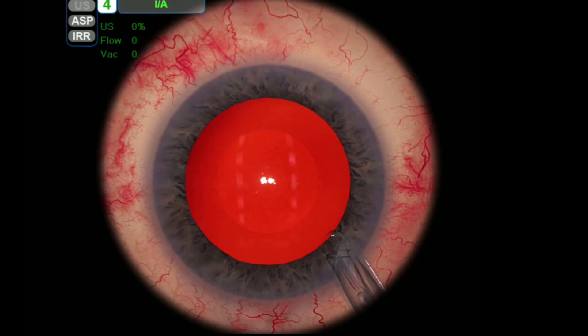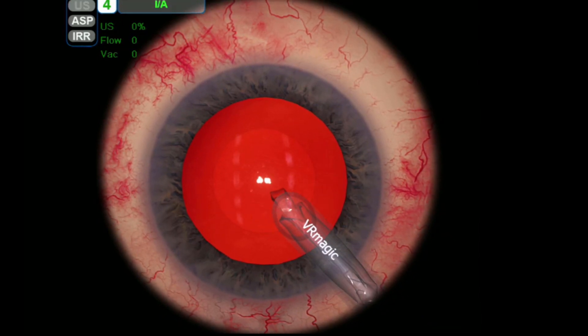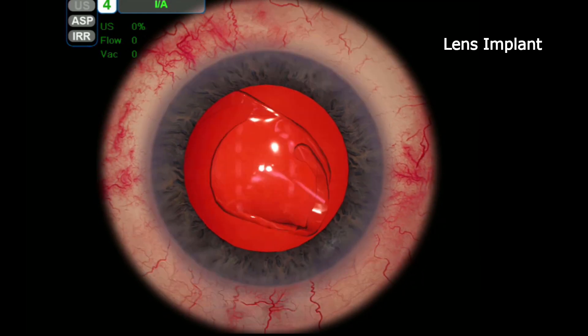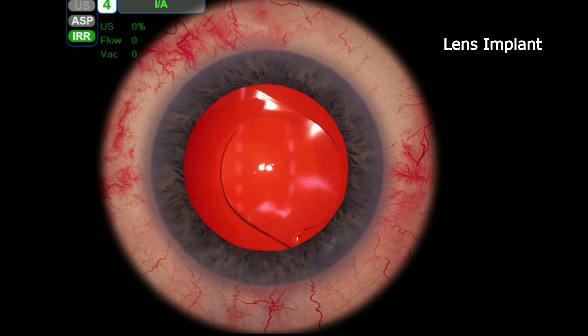The next stage is inserting the lens implant into the eye. You can see it's quite soft and initially folded, and then slowly unravels itself and takes the position of where the cataract was.